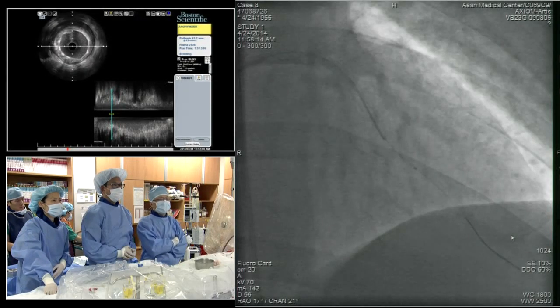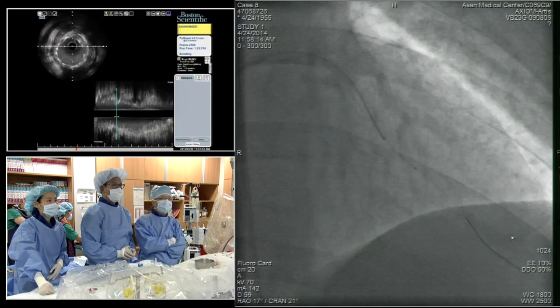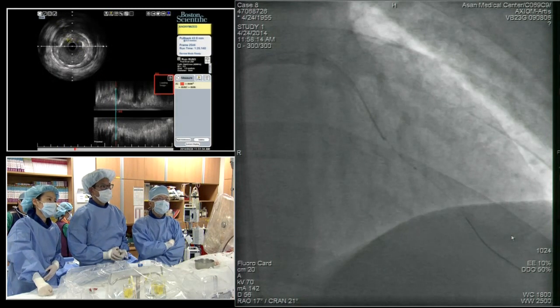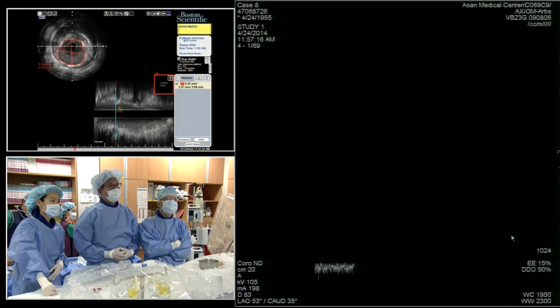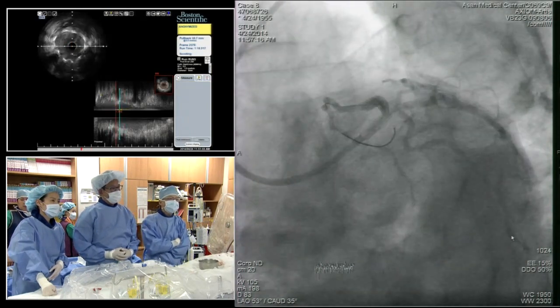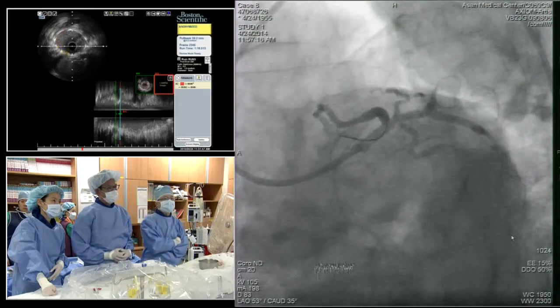I'm probably just going to post-dilate a bit on the original left main distal lesion and the proximal LAD, and then maybe touch up a little bit on the proximal part and be done. Yeah, that looks very, very good. Yeah, I think it looks excellent. I think there's very little you have to do. I think you ended approximately in the left main, right in the perfect spot. Yeah. And I think that there's a great distal transition in the LAD. The branches are not compromised, and I agree. Maybe touch it with a 4.0 balloon and call it a day.